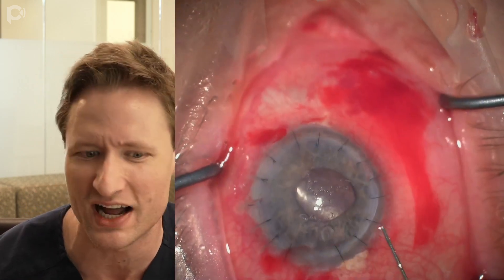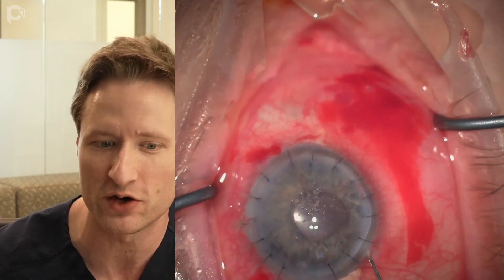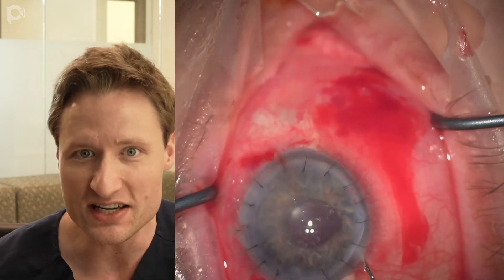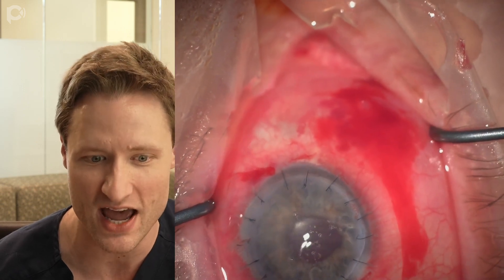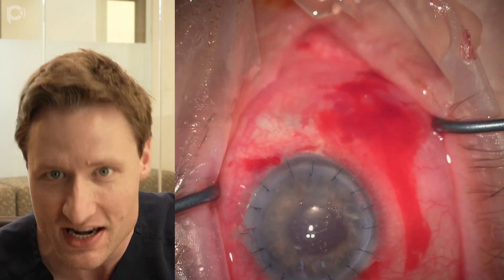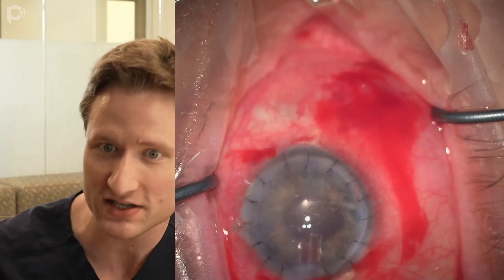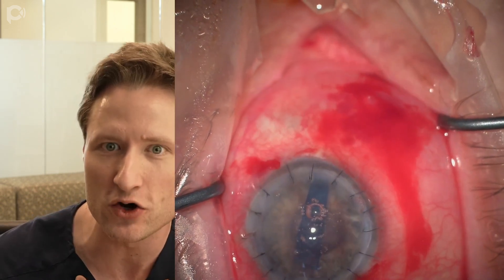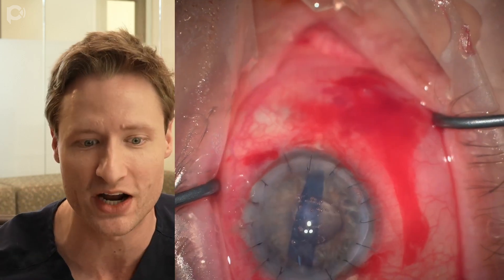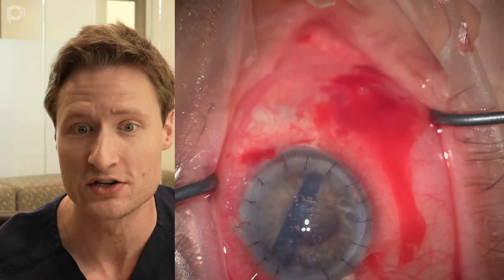The pupil is a bit dilated from the sub-Tenon's block we administered. If it were larger, I'd give Miochol to bring the pupil down before injecting the graft to make unfolding simpler. When doing DMEK under a PK, the key is to use a smaller graft diameter than the recipient PK diameter so you don't overlap the interface — otherwise you'll get a detachment. In this case I'm using a 7.25 mm graft. In my personal experience you also need to use a loose roll, because with a smaller graft there's less compression and pinning, so using a loose roll from a donor aged 70 or older makes it easier to unfold.